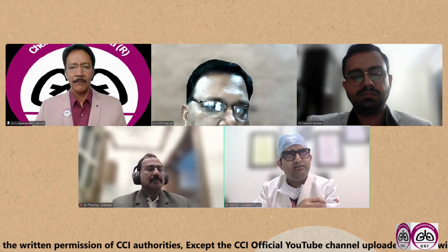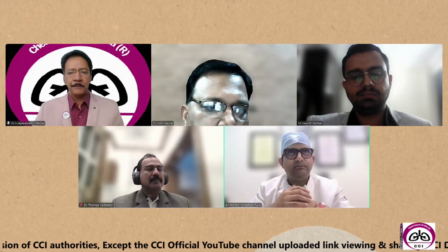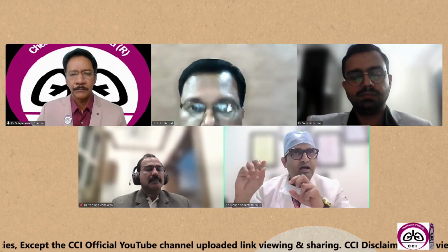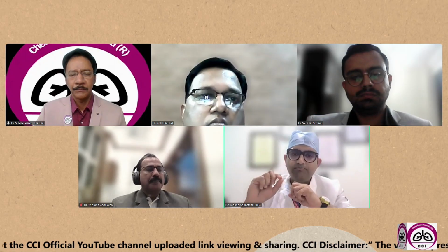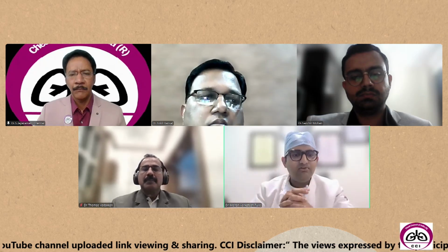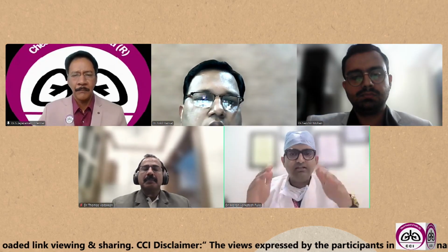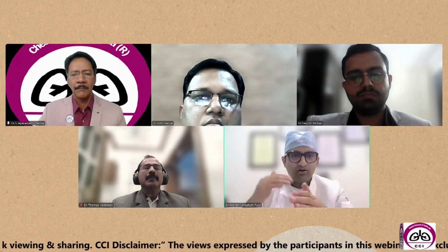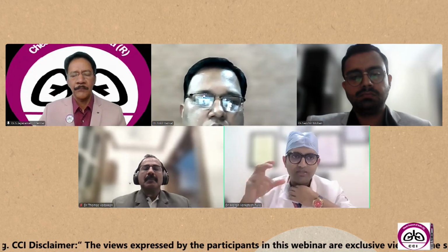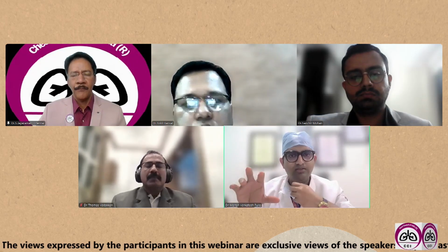However, to my mind, there are three situations I can foresee. Number one is central tumors. There is a big 3 centimeter central hilar tumor, and there is a lymph node in the mediastinum. Clinically it is suspicious, EBUS you have done comes negative. But to the surgeon, it makes a difference between subjecting the patient to straightforward surgery, or giving neoadjuvant therapy and then doing the surgery.